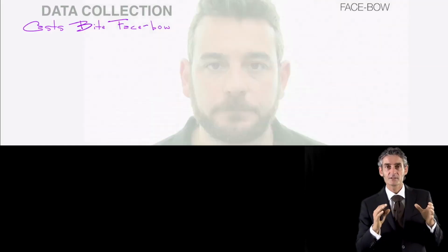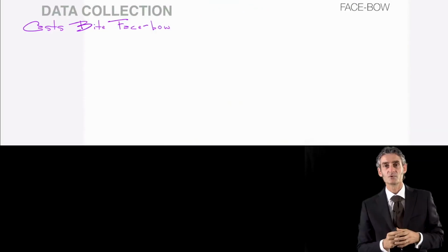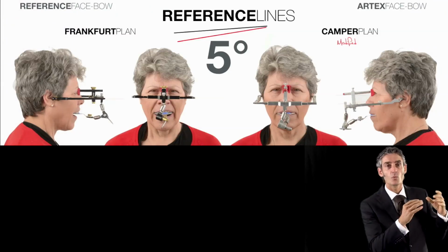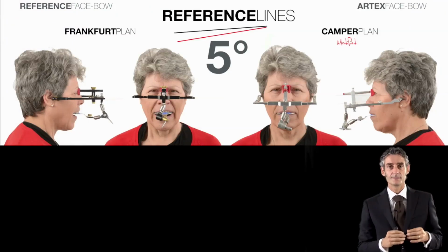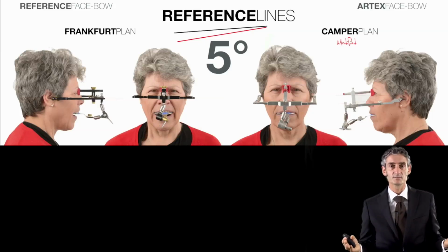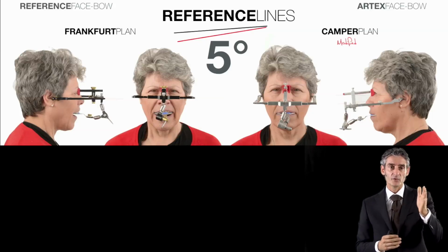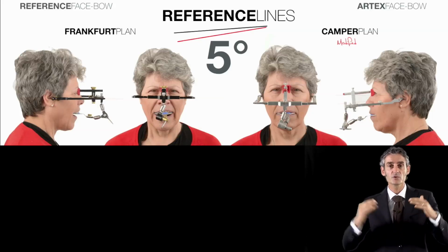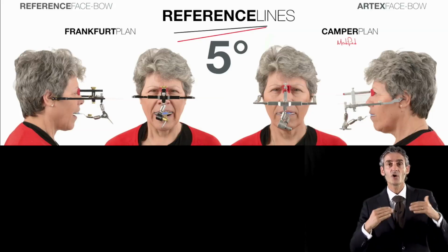Remember that after the technician has this position of the cast in the articulator, if they are not organizing their wax-up or the mounting of the teeth in the right position, it doesn't matter what Facebow we use. So for example, look here, in relationship to different types of Facebow, we have different orientations in the space of the occlusal plane.